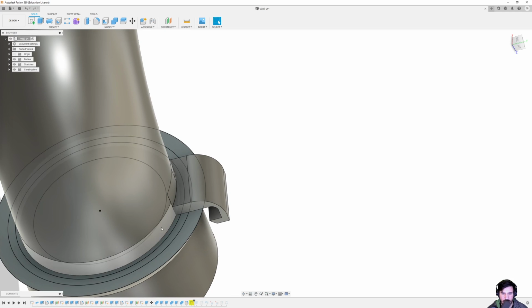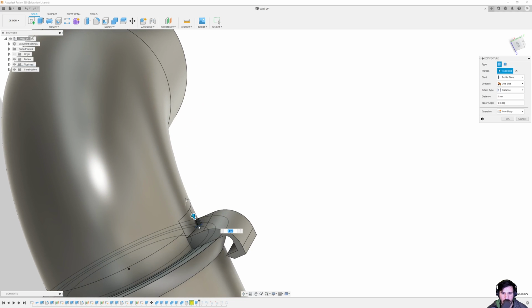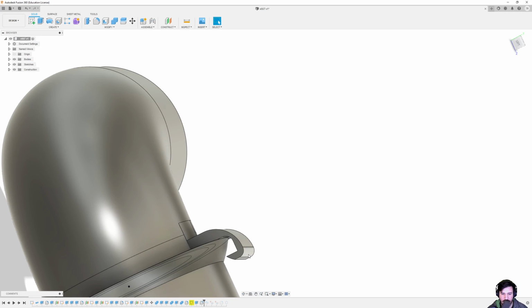It was a little nub right here that I end up extruding out. Oh, no, there's something else. What is this? Oh yeah, it's this. The start of that gets extruded. And then I put a fillet on the front there just to make that a little bit nicer looking. That's pure aesthetics, really.